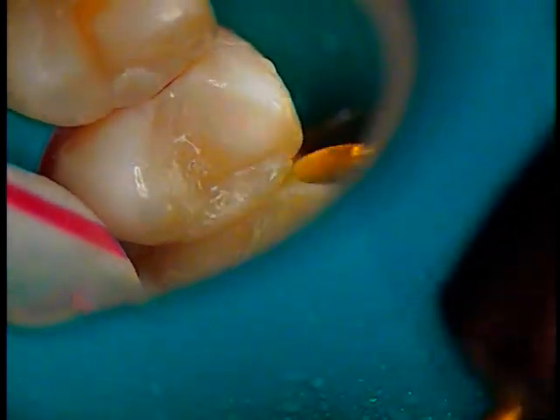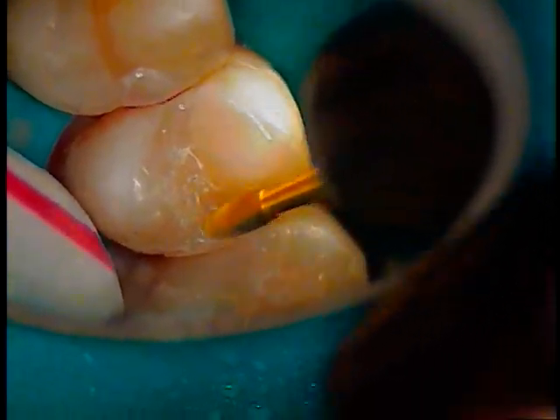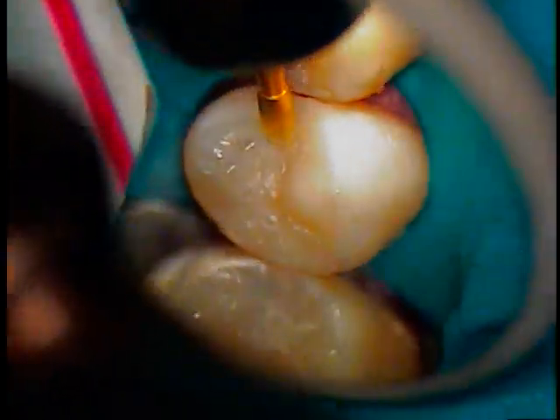I don't have anything that's going to catch food or cause issues. And I'll even take a scaler. I'm not gouging here, I'm just polishing lightly. It's a feather touch, by the way. Feather.